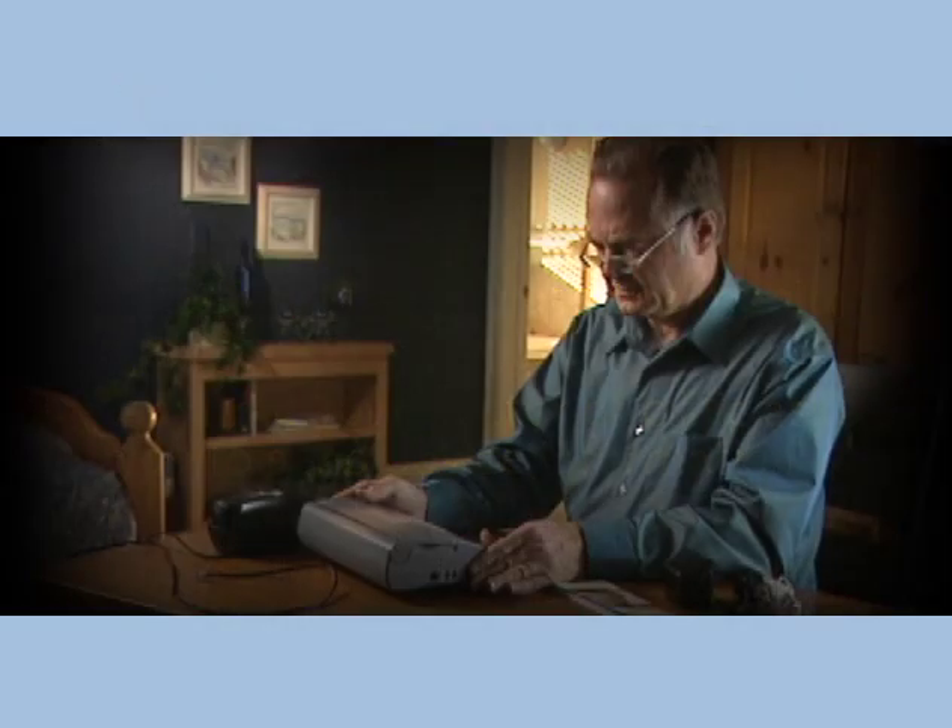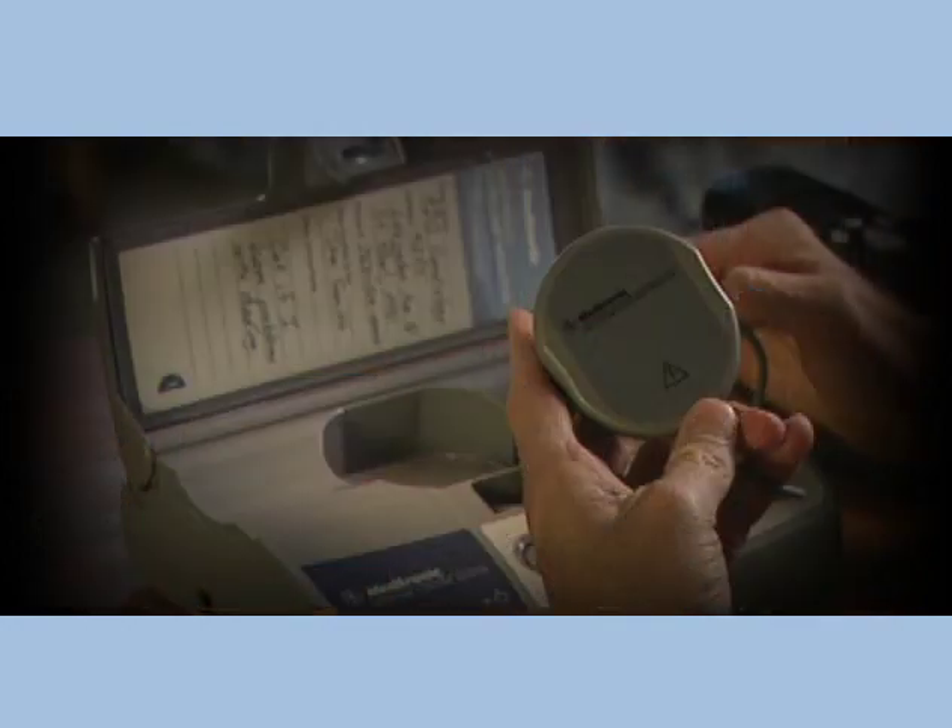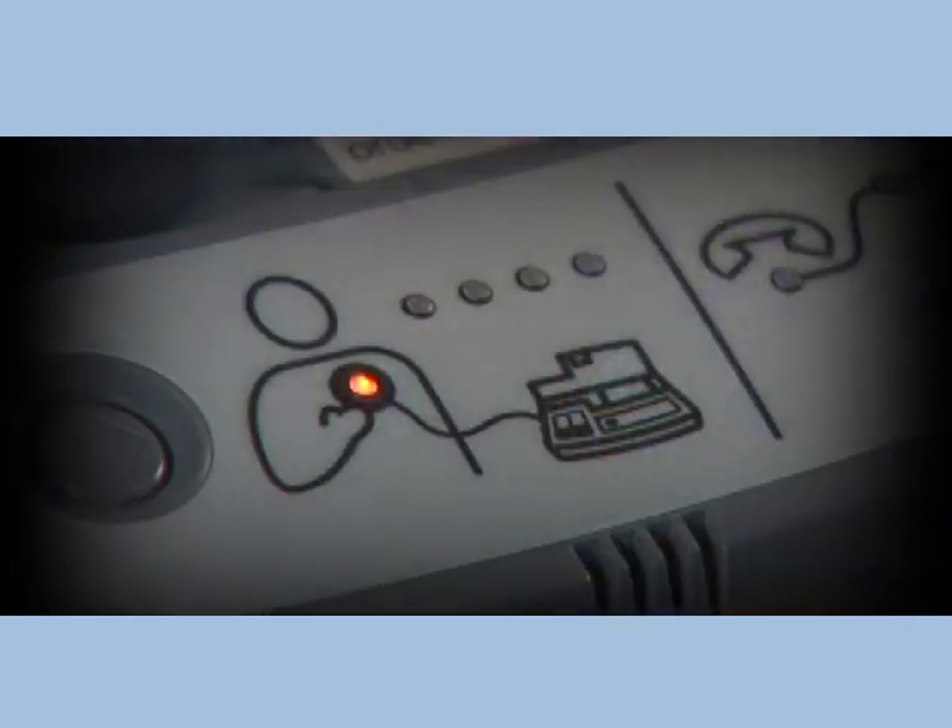First, we'll show you where to put your monitor, how to perform the set-up session, and how to send heart device information at times requested by your clinic. Then, you'll learn how the automatic wireless transmission works. This video also includes troubleshooting and other important information.